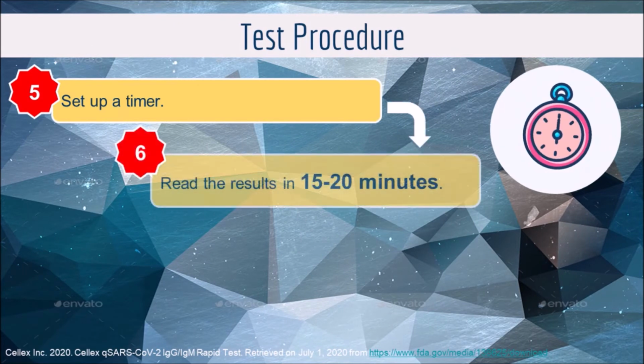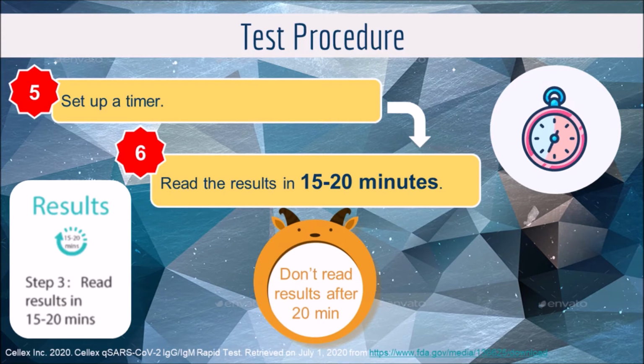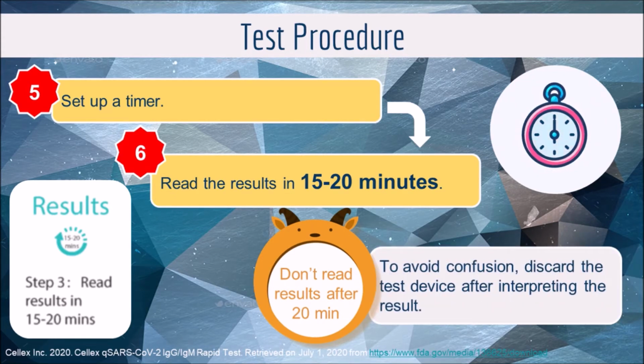Next, we have to set up a timer and read the results in 15 to 20 minutes. The results will be invalid after 20 minutes, and to avoid confusion, discard the test device after interpreting the result.